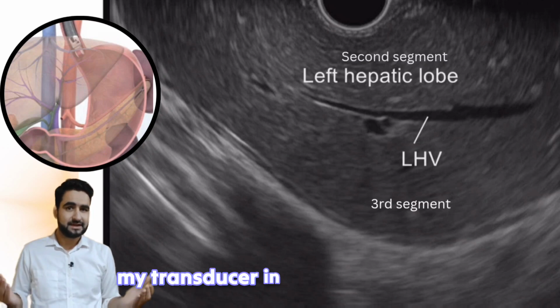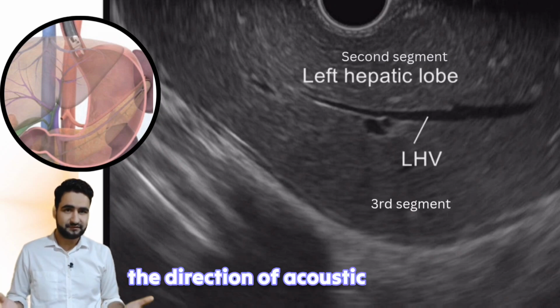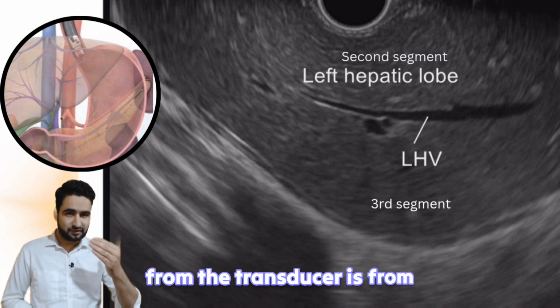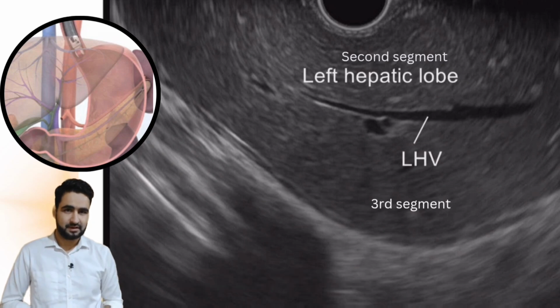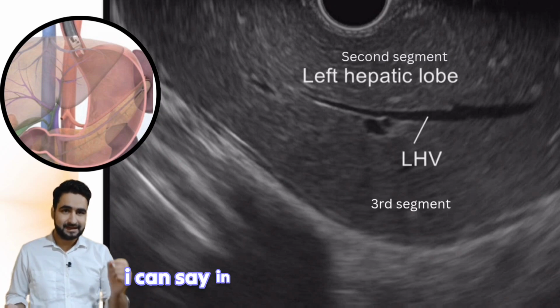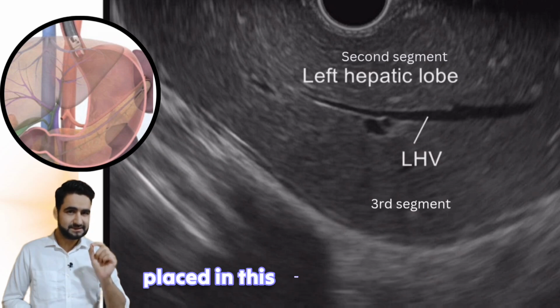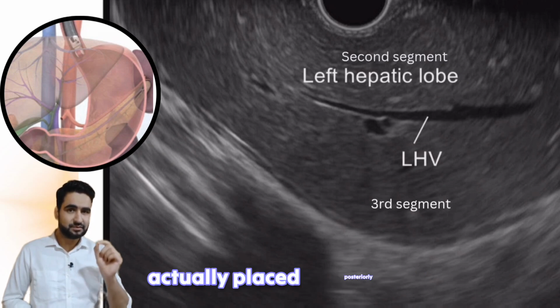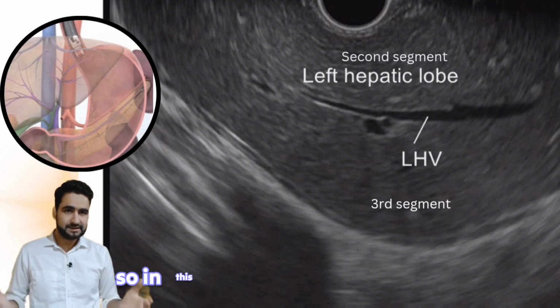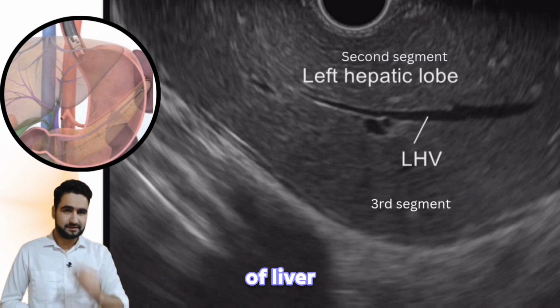My transducer in neutral position is facing anteriorly. The direction of acoustic waves from the transducer is from posterior to anterior. So the structures that appear closer to the transducer will be placed posteriorly. In other words, I can say in this neutral position, structures that are superiorly placed in this EUS image are actually placed posteriorly.